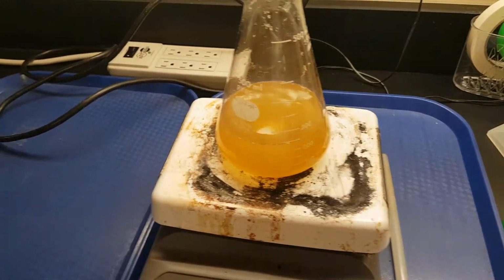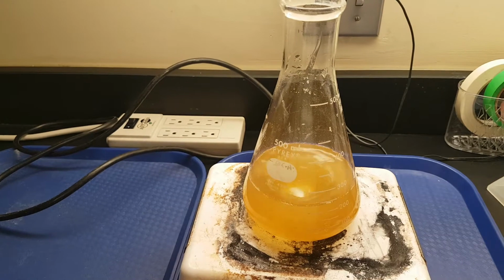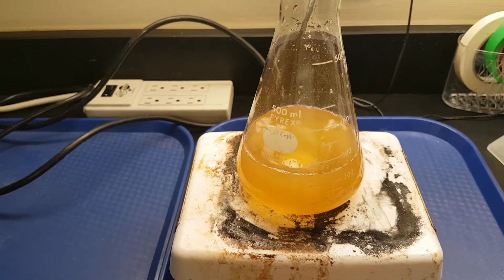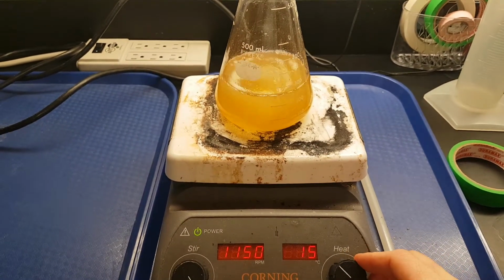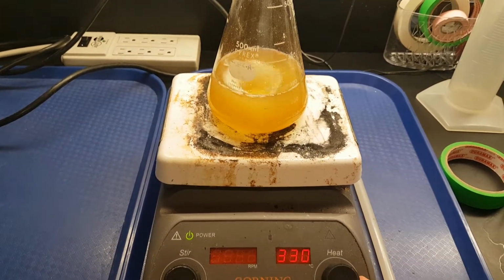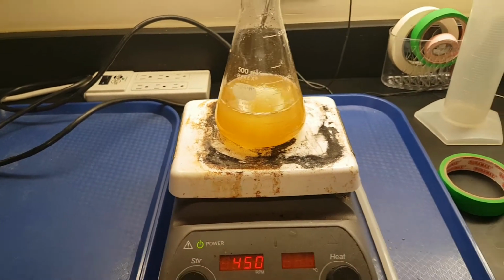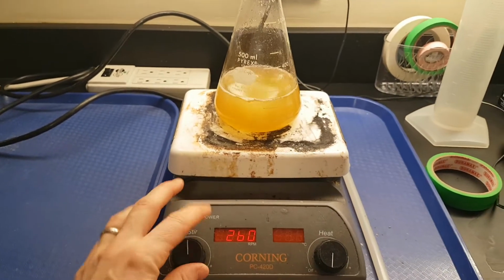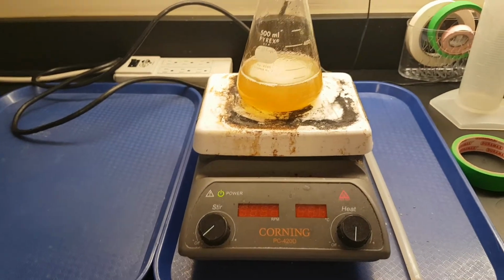You do want to make sure that it's stirring when you add it, because it can clump up, and it very well might do that anyway. What we do with the agar to help it dissolve completely is we need to boil it. So we would turn on the heat, and not necessarily the stirring all the way up, but you do want the stirring happening.